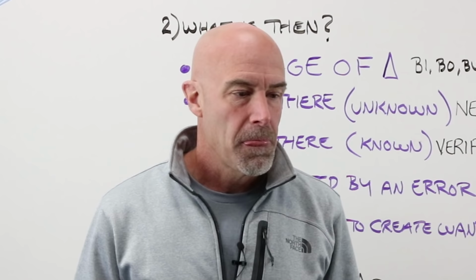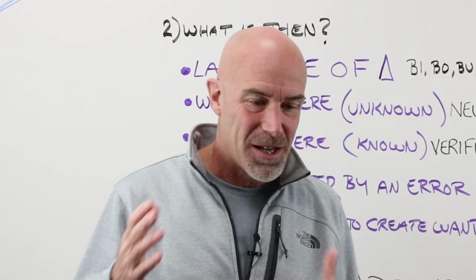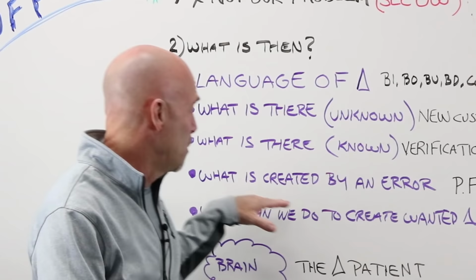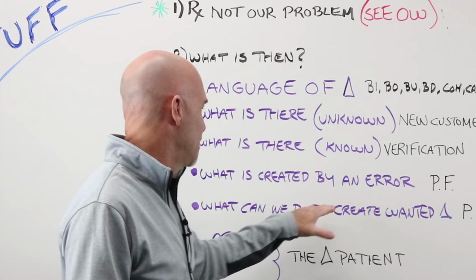If a job is wrong, send it back. If I get a pair of glasses in, I'm doing verification, I'm looking at them, they stink, the PD's off, the imbalance is this way, one OC's here, one's here. I'm not going to go through all this rigmarole and work Prentice's formula and say, "Well, it comes within tolerance." No, it was made wrong. Send it back. Just always keep that in the back of your mind.